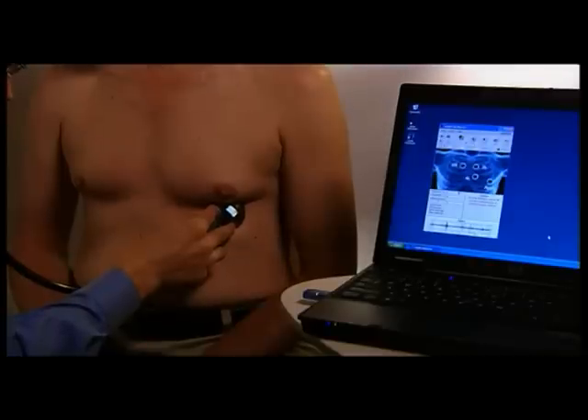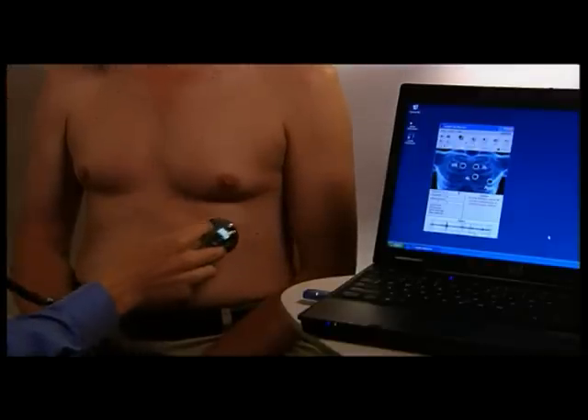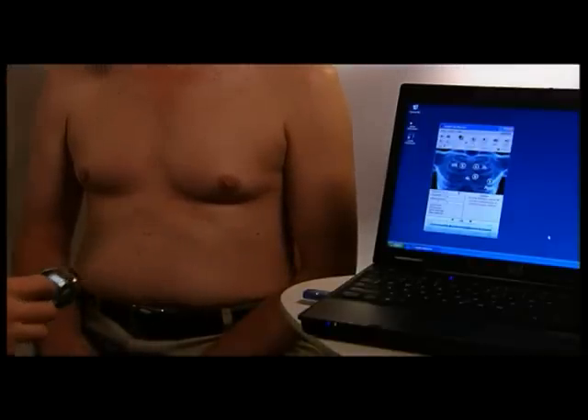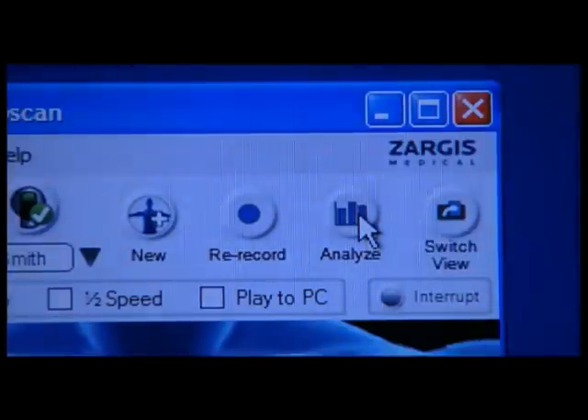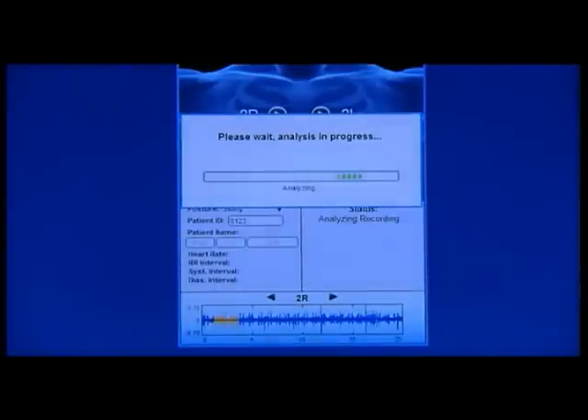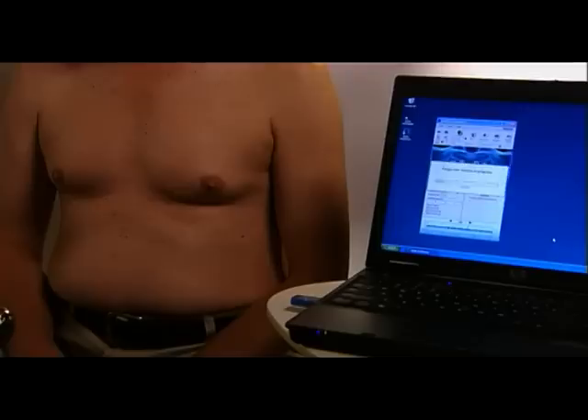After the four recordings are complete, press the M button on the Littmann Model 3200 stethoscope, or the Analyze button on the top right of the Zargis CardioScan software. The Zargis CardioScan software analysis algorithm will then take approximately one minute to compute, depending upon the processing power of the PC, and produce the Zargis CardioScan software analysis results.